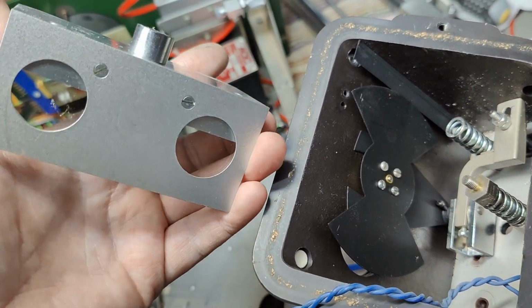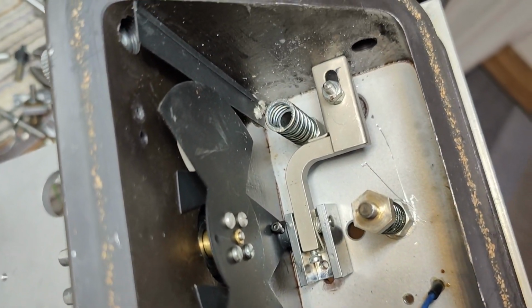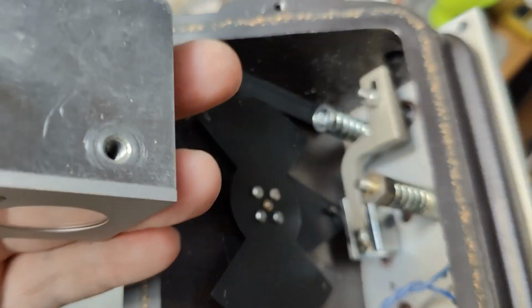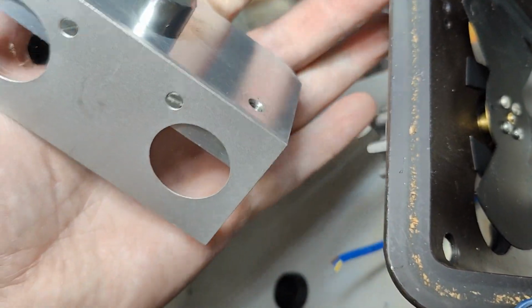So I finally got this thing out. So yes, this one can move up and down and all that kind of stuff. There's a little bit of mechanical things here. I had to remove half of it to get in there. So everything is just made so impressive. Look at the thickness of this aluminium piece here.